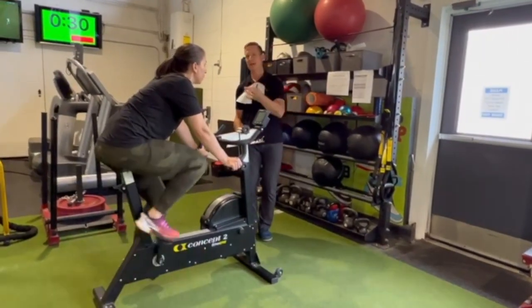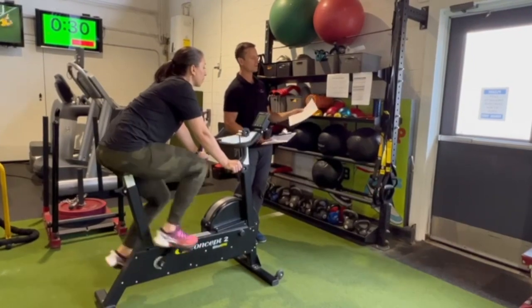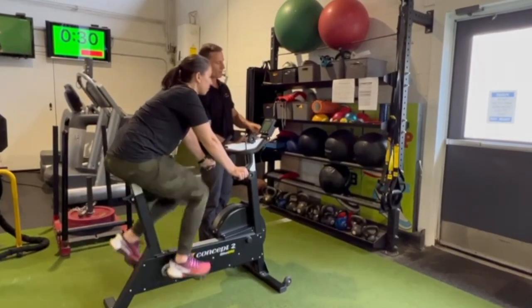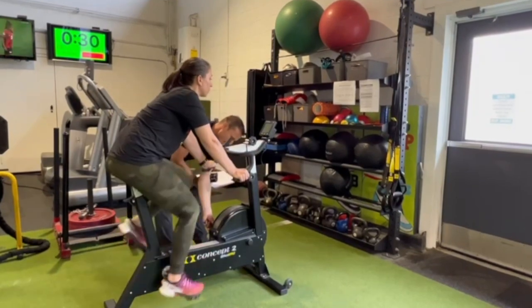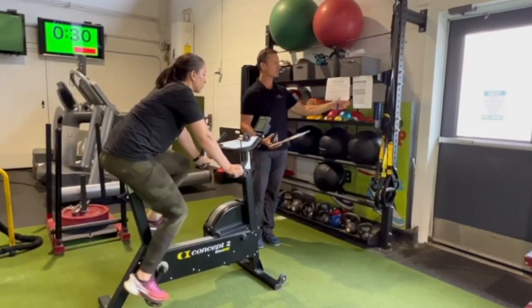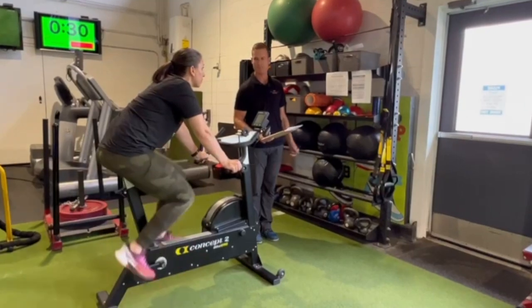So for this athlete, we've identified her body weight, and so we know that every 2 minutes we have to increase her wattage by a certain amount. So we're at phase 1 here. At 2 minutes, we want you, Laura, to go up to 47 watts, and I'll increase the resistance just slightly. You keep your RPMs the same. So every 2 minutes, we're going to ask how hard you're working. So from 6 to 20, how hard do you think you're working right now, Laura?